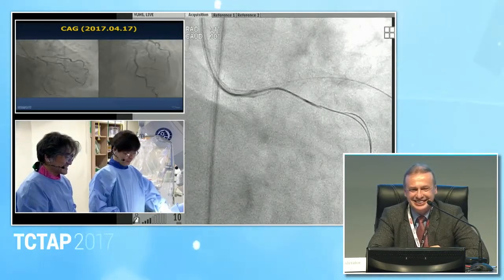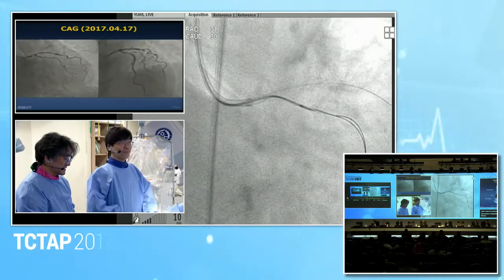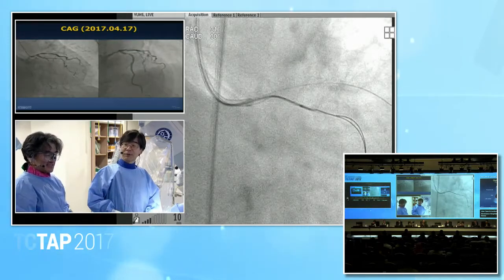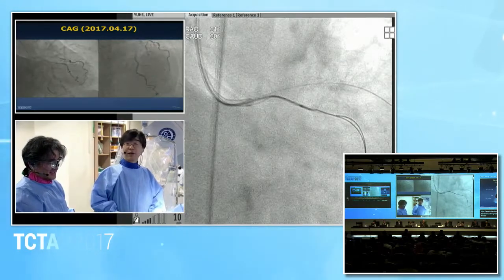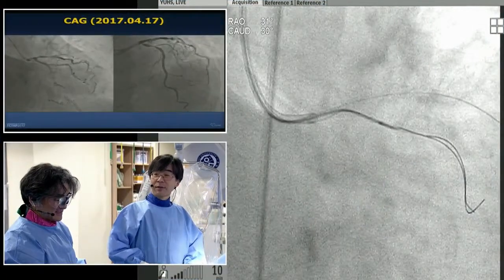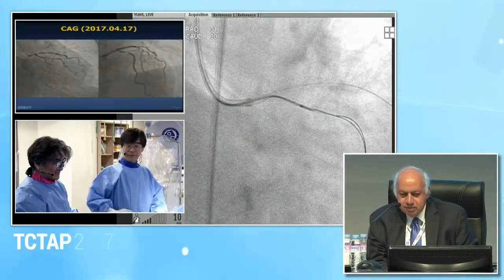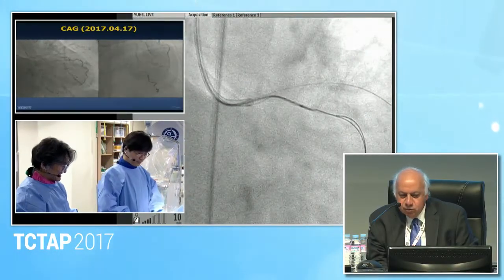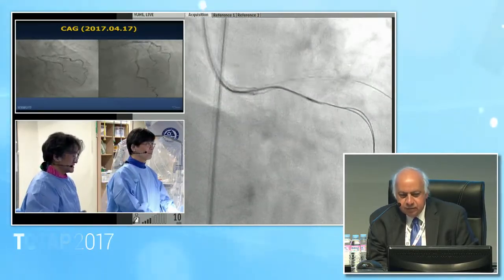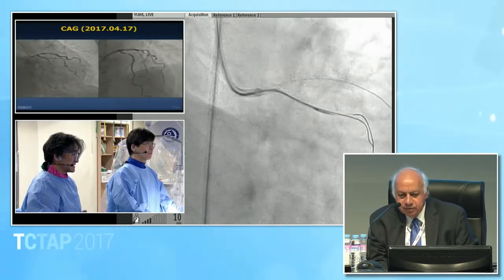Okay. Is it mandatory to open the struts of the left main to the circumflex? No, I don't think so. It depends on the physiology assessment. If the FFR value is less than 0.8, we will dilate. This is very important because in the past it was routine, but nowadays we are not using this. If the FFR is normal, we are not going to open it, because they're claiming that if you open these struts, it allows further examination of the circumflex, if you can go inside without endothelial proliferation.